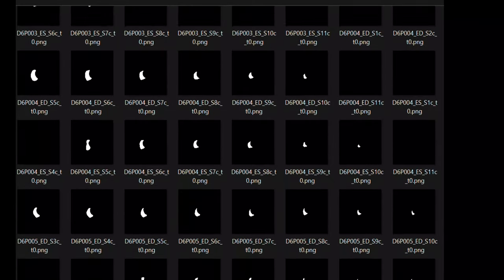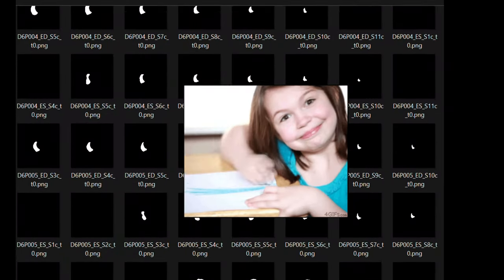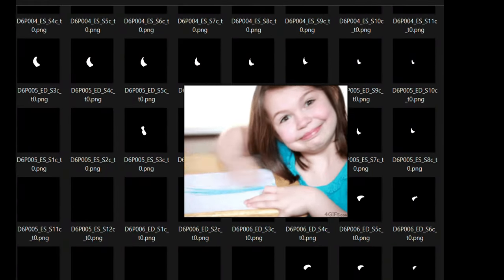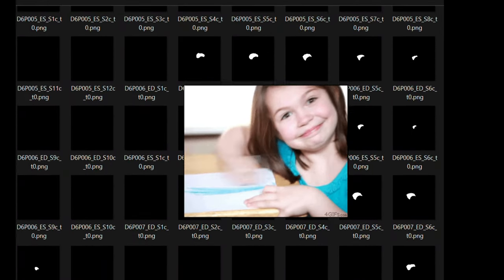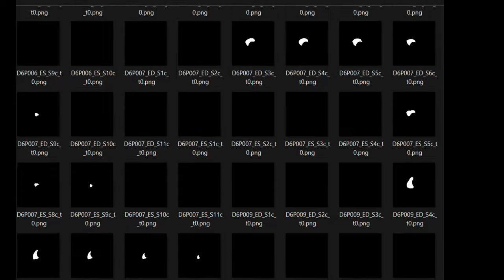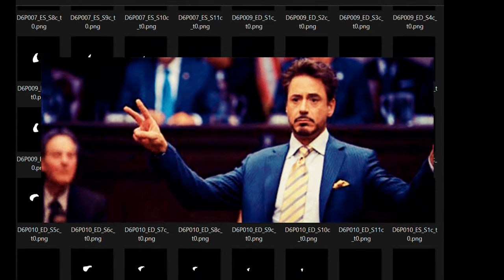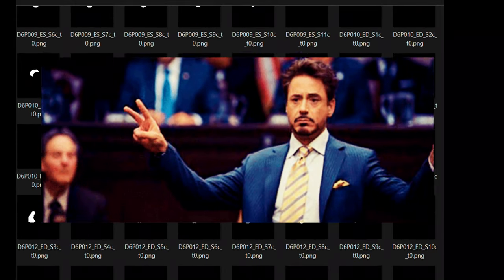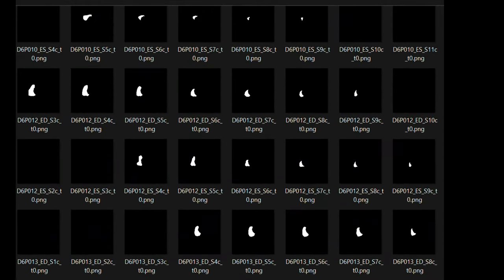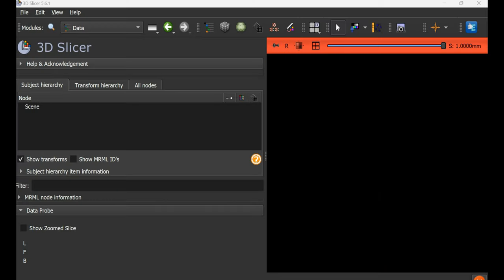Suppose you have ground truth masks created by an intern that need to be edited or validated by a senior expert. It is possible to do this in 3D Slicer.